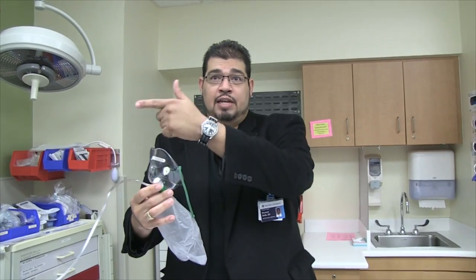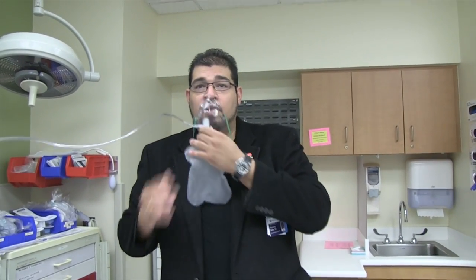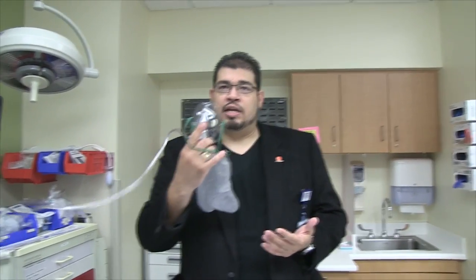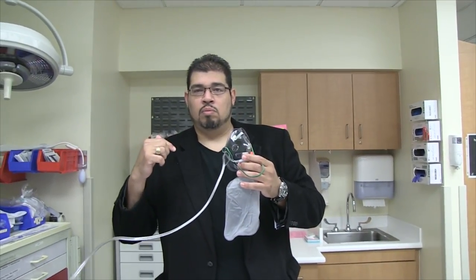So now, if I am the patient and I am really, really short of breath and I'm breathing at a minute volume that's higher than 15 liters per minute, which is the flow in here, I'm overwhelming the system. And of course, I'm not going to want to keep this on my face. I'm going to try to hold this up like this or get rid of it completely. The reality is that you're asphyxiating them because the flow in is less than the flow out.